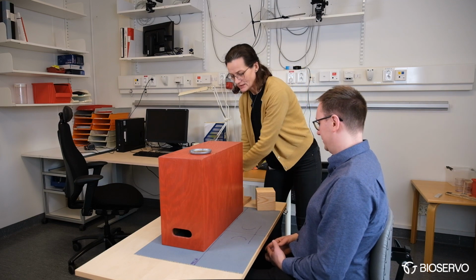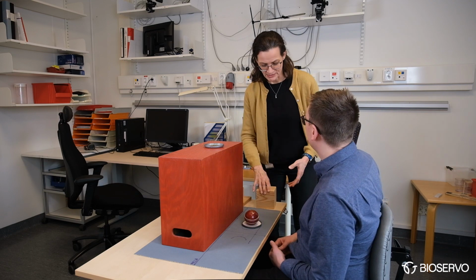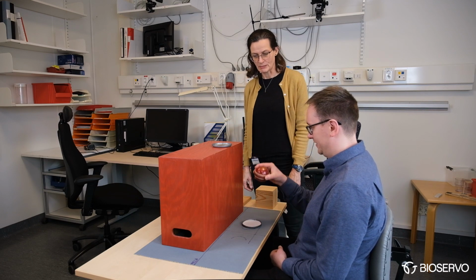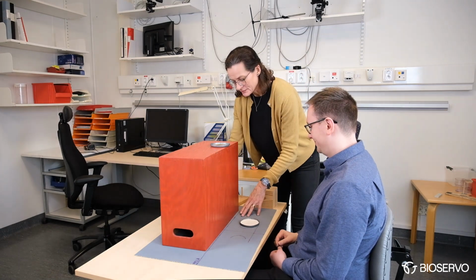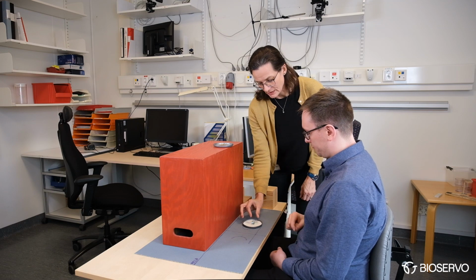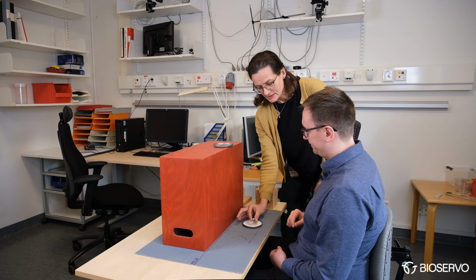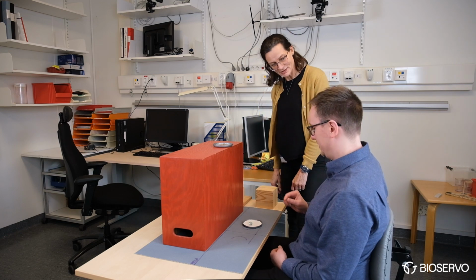Okay. And another task, for example, here is when we look at different grasps. So this is a big grasp, but we look at this kind of grasp. So I ask you to put the ball up there, and then you take the arm back. And even if I want to see even smaller things, more precise movements, at different sizes of marble here, you can take it with different fingers, but you can just take it with your finger and put it up there, and then you take your hand back. Okay. You can try that.